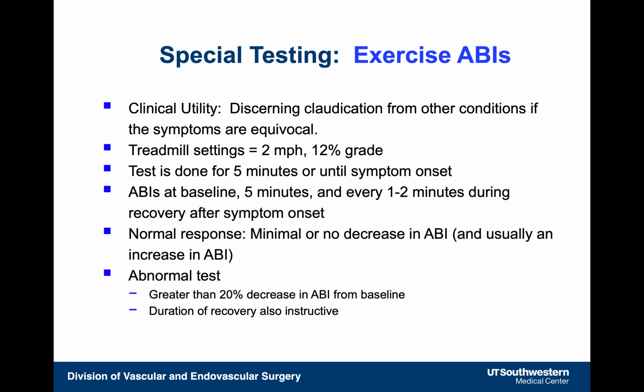And actually what's particularly instructive in many cases is the duration of recovery. If you have a very slow, prolonged recovery, I think you can rest assured the patient really has claudication, and those are the people who are more likely to have lifestyle limiting claudication.